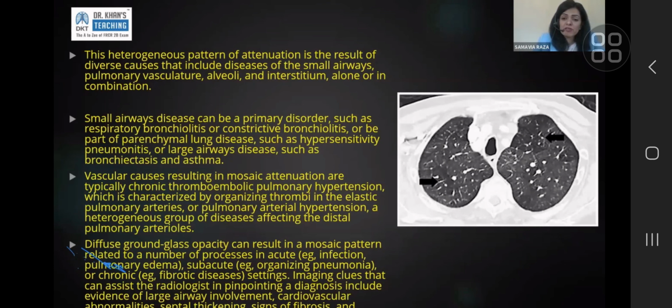Instead of focusing on the small vessels in the lung parenchyma, you can look at the main pulmonary artery. You can look at the main history of the patient, the right heart thickening, the right heart dilatation. Signs like that are more helpful than focusing on the micro vascular structure of the lung on CT.